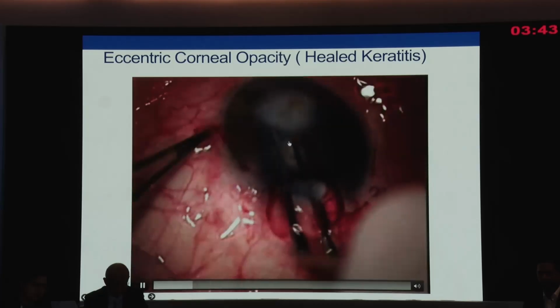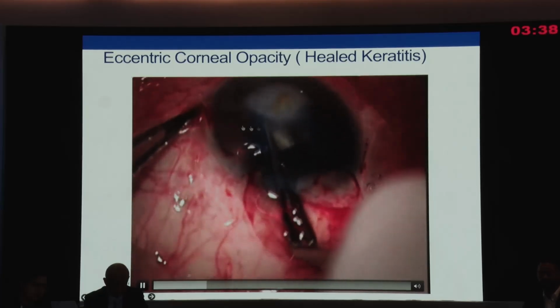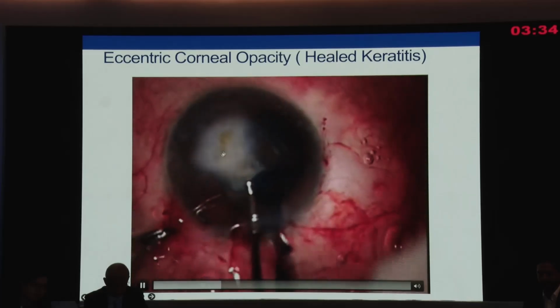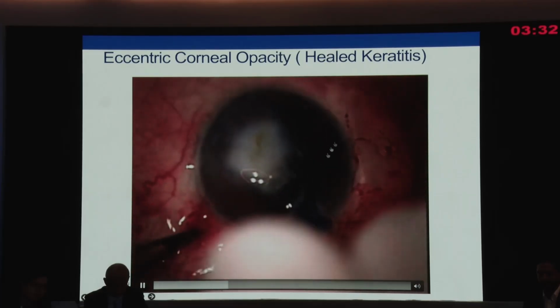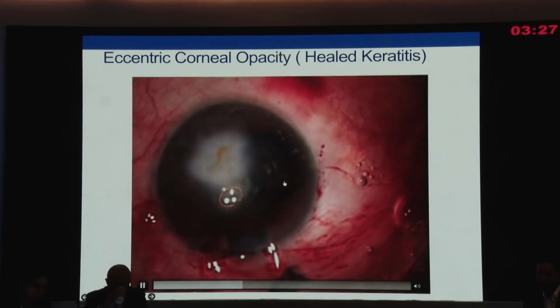This half of the cornea is clear. Then stain with trypan blue dye, and then push the globe a little bit to see the edge of the rhexis there. And when you come in this area of the haze, then go in one go. Now, there's an optical iridectomy there, so eccentric rhexis and eccentric crater.